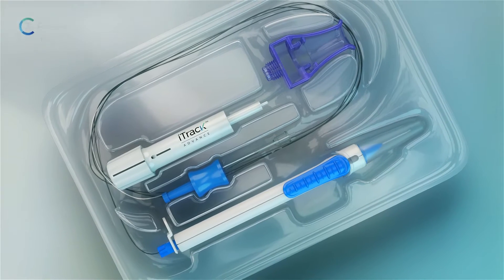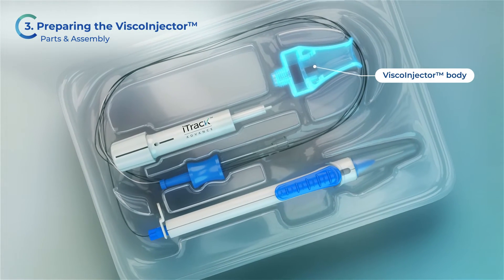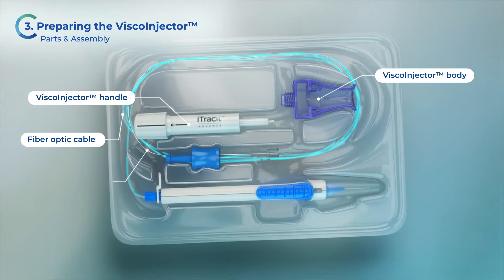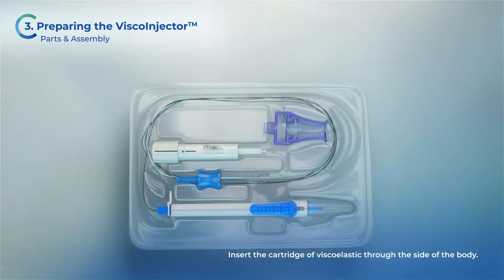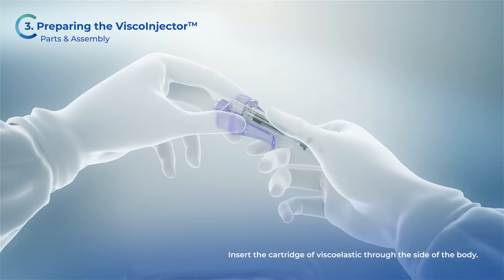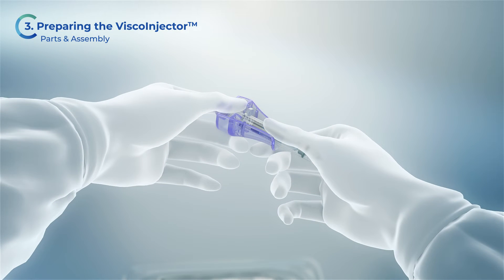Inside the tray, you will find the viscoinjector body, the viscoinjector handle, the black fibre optic cable, and the clear infusion line. Insert the Helon cartridge through the side of the body of the viscoinjector. You will hear an audible click as the Helon cartridge is properly inserted.